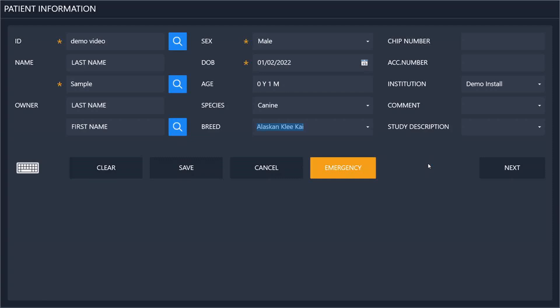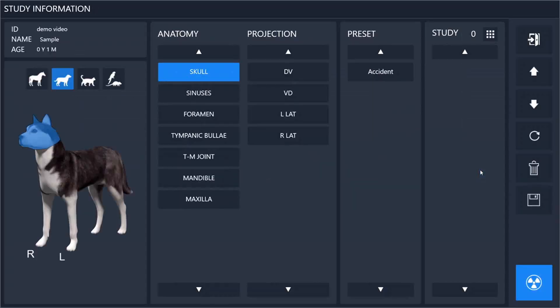If you are going between multiple locations you can have multiple institutions, or if you are having patients sent to you from multiple different practices. Click next and we will go to the study information screen.